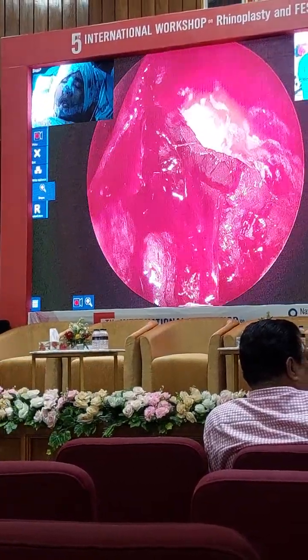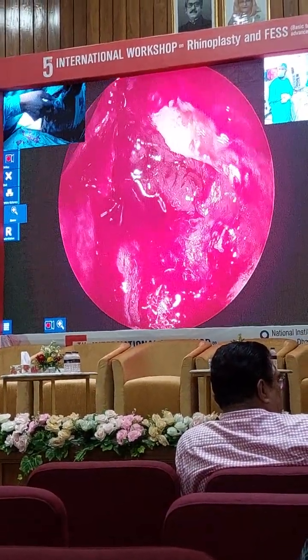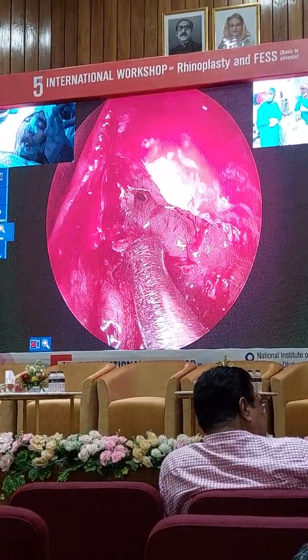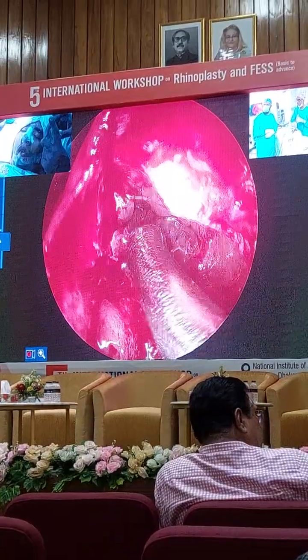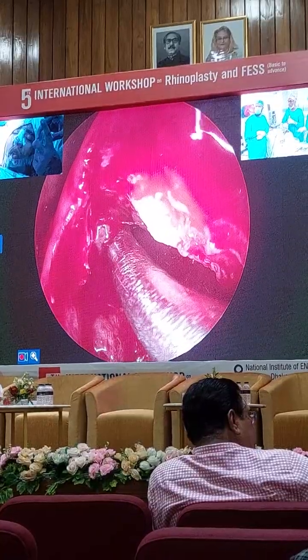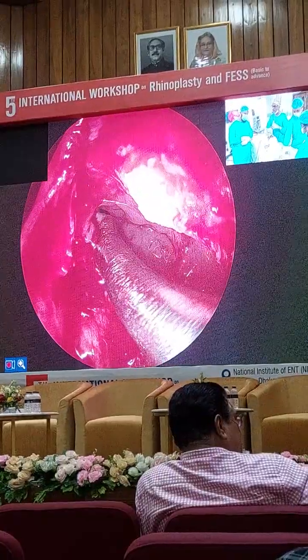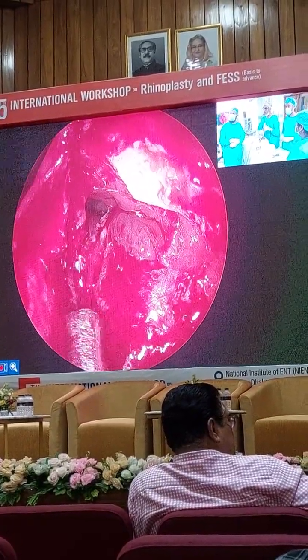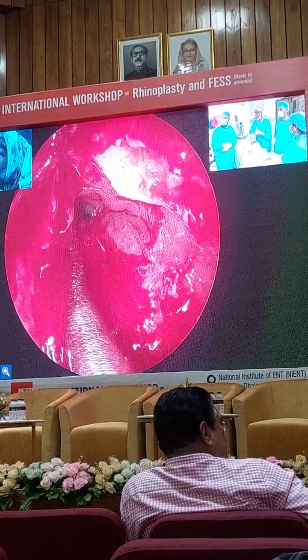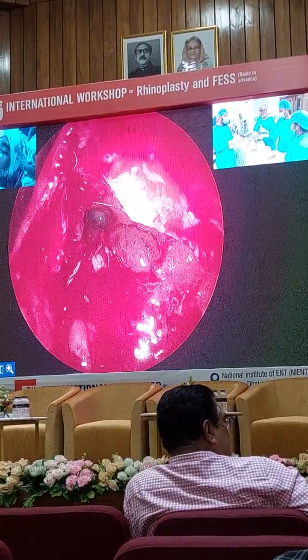Okay, small piece of bone that comes out. Now I know my frontal drainage pathway is between the suprabulbar medially and the ethmoid sinus laterally. Can you see already one opening there? Okay, so give me a seeker now, and with a seeker I'm going to see if that corresponds to my frontal sinus. But you can see how I'm only sucking on the way out, not on the way in. No suction. Only now as I come out, I can see. So by using suction in this method, I can get into my frontal without causing trauma.